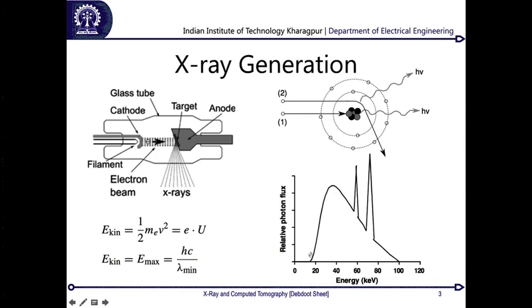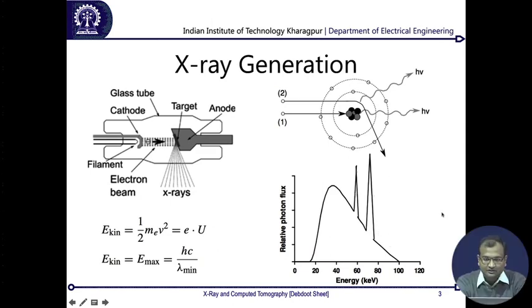Now over here you would see that there is some sort of a modal maxima, and there are two peaks which are greater than the modal maxima over here. Now they correspond to very interesting facts. The first one is basically the K shell energy peak. So this is about the electron going over here and just sitting in the K shell. If it just sits in this K shell, then it's going to release all of the energy which it was having over there, and that corresponds to this energy of 69.5 kilo electron volts.